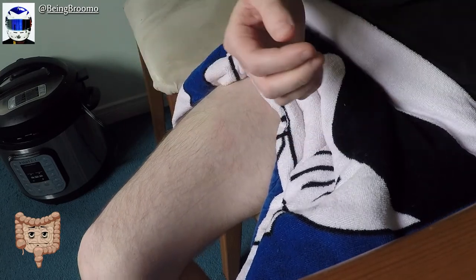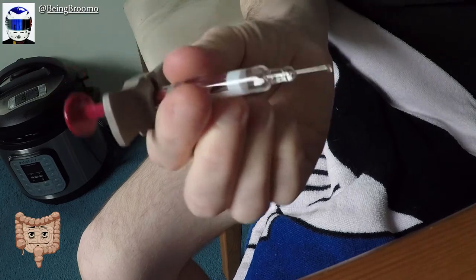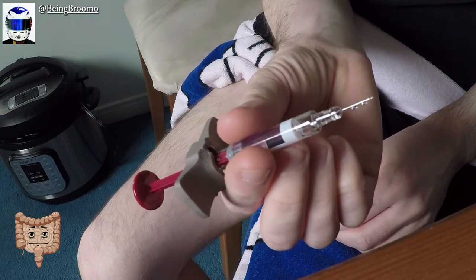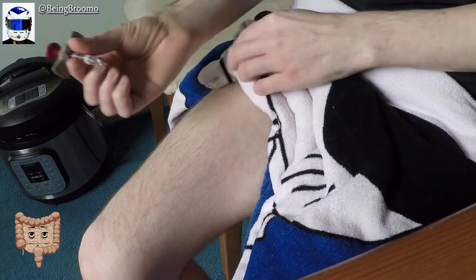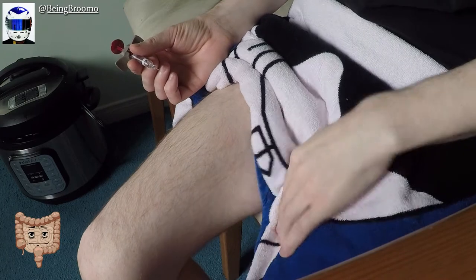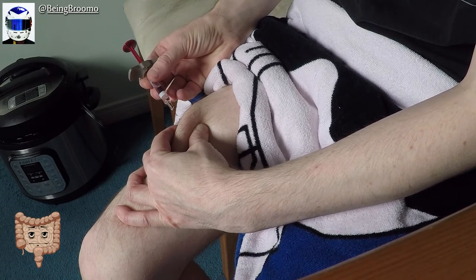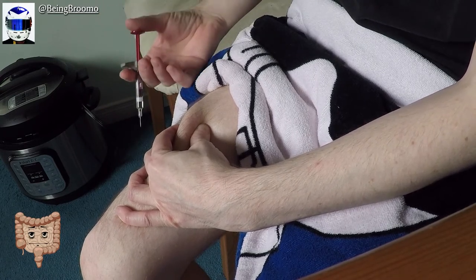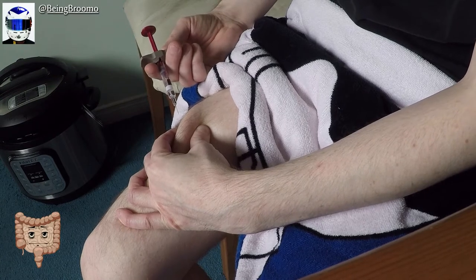And then I get nervous. It's dripping — shouldn't be dripping. So there it is, that's how long it is. It shouldn't be dripping; we shouldn't have to squeeze out any air or anything. This is the part I'm nervous about. I've never done it myself and I don't usually look. I've looked once, but that was a long time ago. You don't want to push it in like this because that will push out some of the medicine. I'm just going to hold it like this for a bit — 45 degrees in, into the skin.